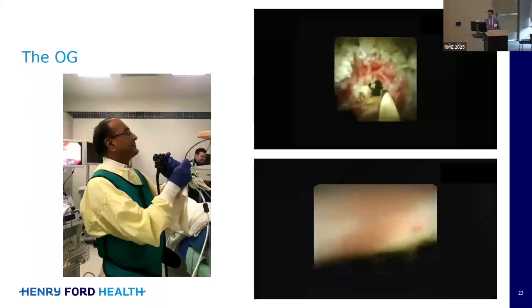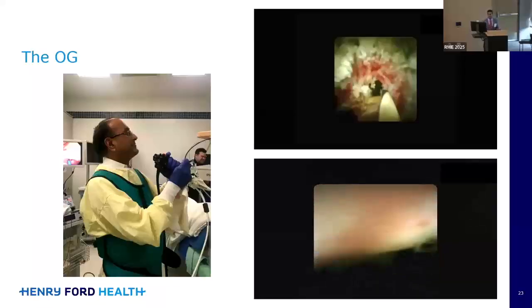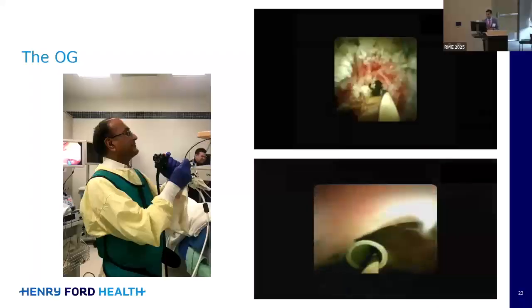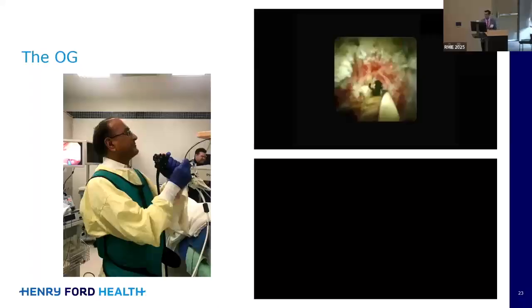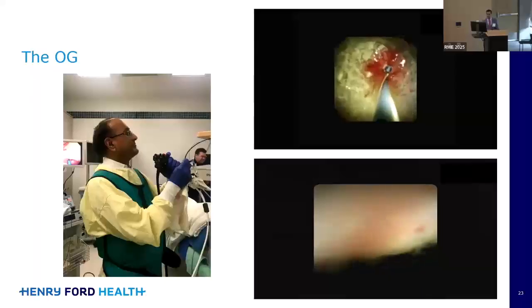And we've all been in the dreaded situation where there's a migrated plastic stent, and we go through our algorithm of what to do next. And I found cholangioscopy to be a tremendous rescue. You can see kind of blindly passing a wire that goes through, and you're like, yes, we're all good. We're going to get that stent out today. So this is really a tremendous technology.